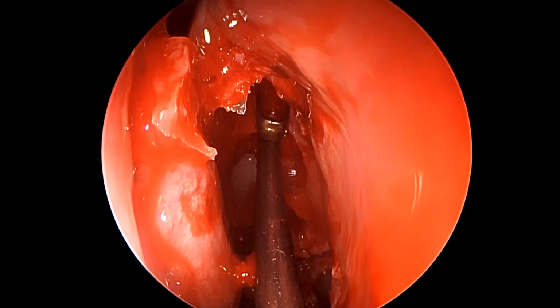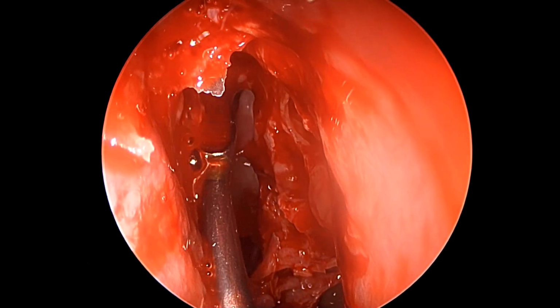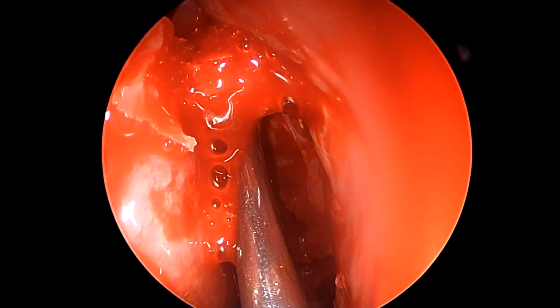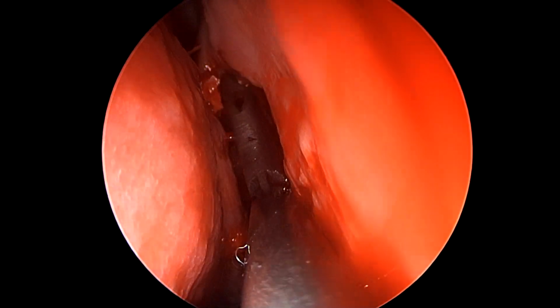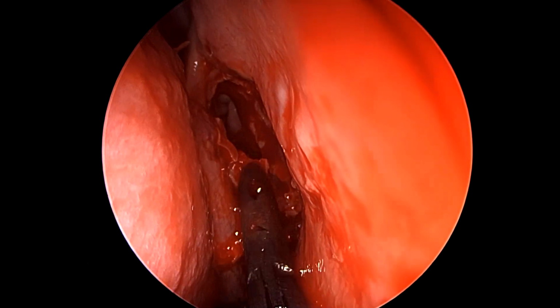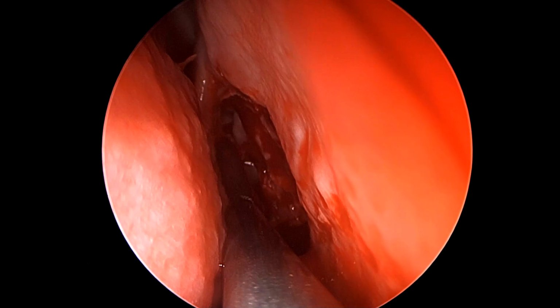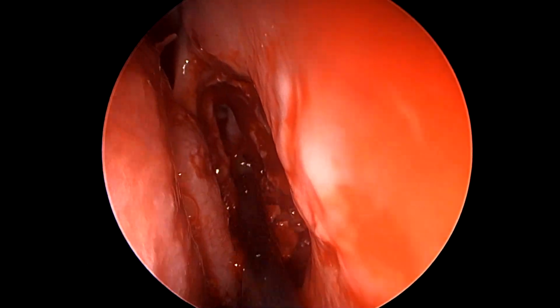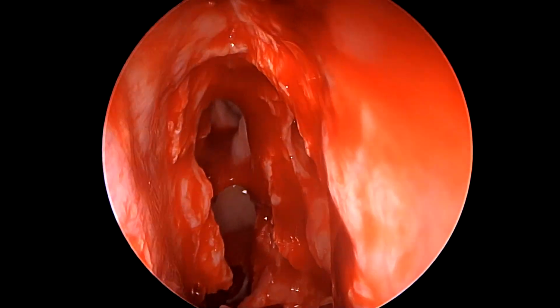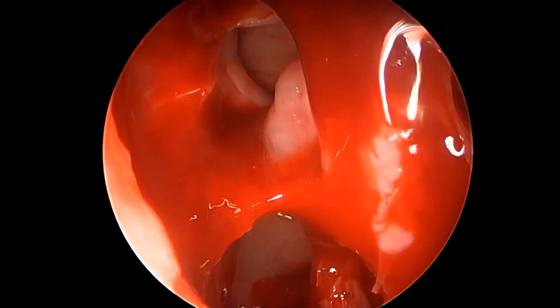As you must remember, there was a large suprabullar cell that was pneumatizing along the posterior wall of the frontal sinus into the frontal sinus proper, imitating a frontal bulla cell or a type 4 cell, but actually it is not so. It is a suprabullar cell that has pneumatized along the roof of the skull base inside the frontal sinus. Making this distinction on a parasagittal cut and on a coronal cut is very, very important, because that would dictate your approach towards the frontal sinus.